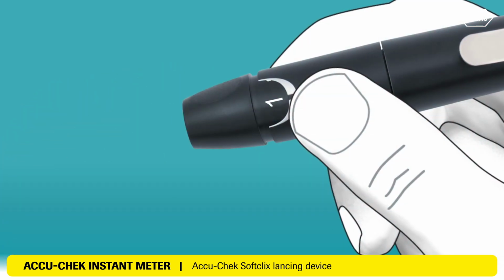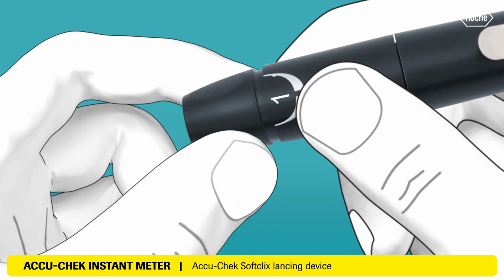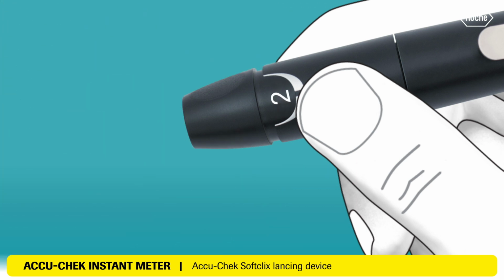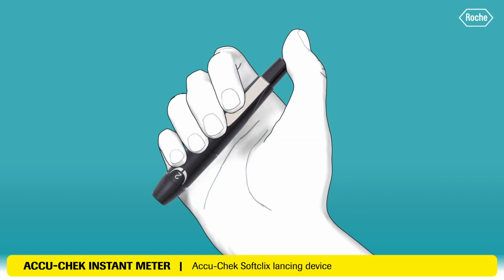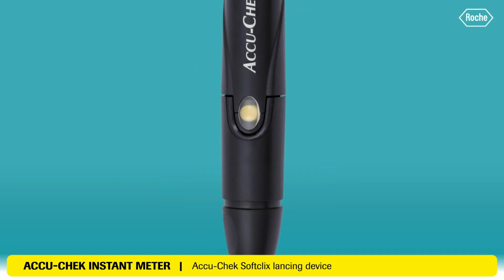Next step is to set the penetration depth to match your individual skin type. By turning the dial on the cap, you can select the depth of the lancet. Set the dial to 2 to begin with. You may need to adjust the setting a couple of times until you find the right level for your skin type. To use the lancing device, you first need to prime it. Press the priming button all the way down. The release button on the side of the lancing device has now turned yellow. This indicates that your lancing device is now primed and ready to use.